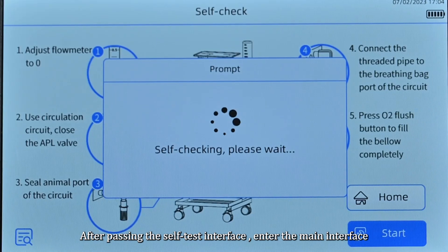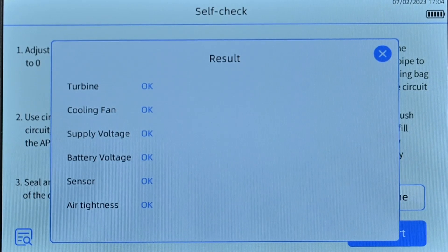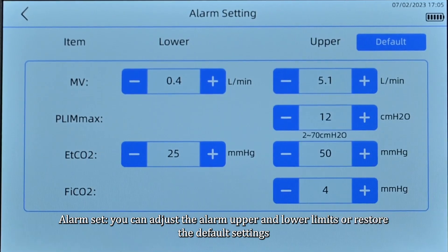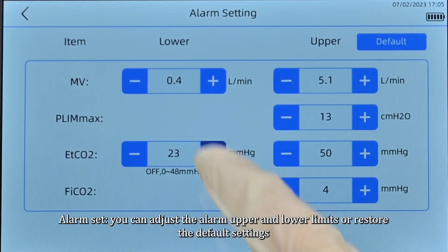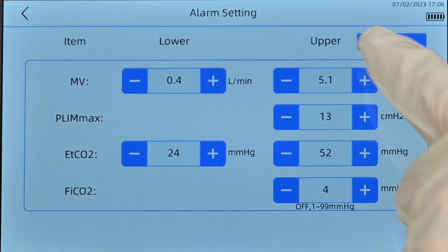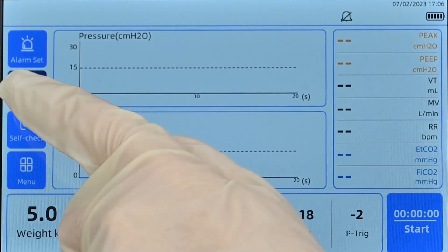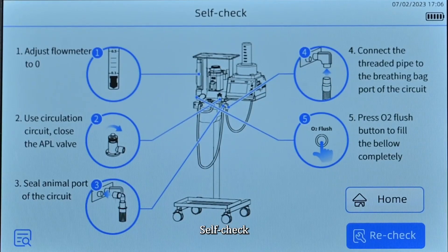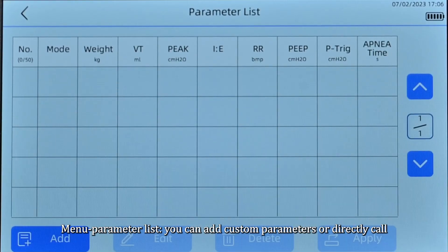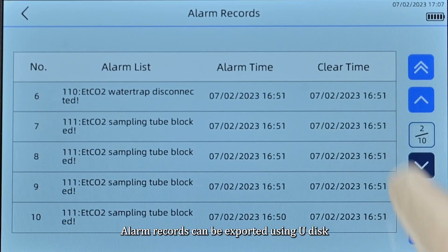After passing the self-test, the interface enters the main interface. In alarm settings, you can adjust the alarm upper and lower limits or restore the default settings. In the menu parameter list, you can add custom parameters or directly call alarm records, which can be exported using a USB drive.